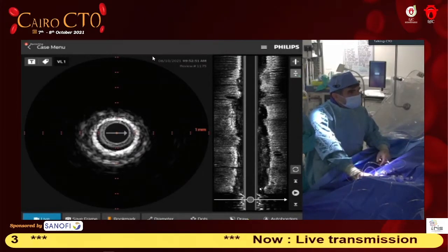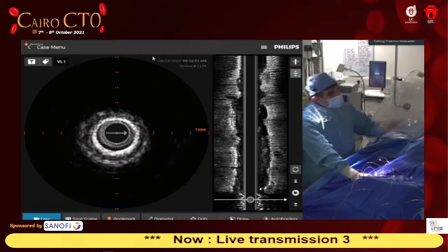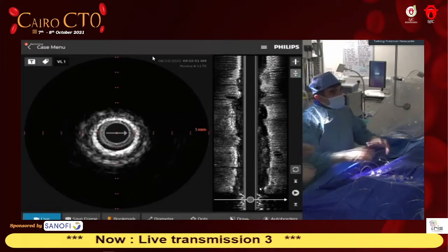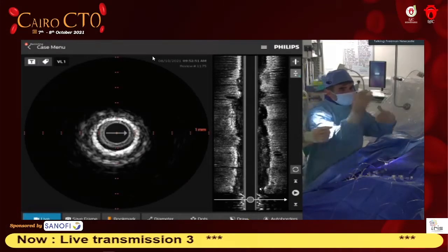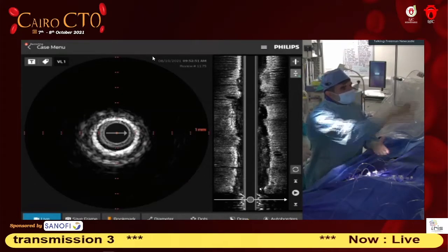So you'll put nearly 3 stents, right? I think. Yeah. I said this will grow. I've got no doubt that it's going to be bigger, but because of the nature of the disease, we're just going to start with the 3.0. And Zions could go up to much higher pressure. It could go to 4.25 if we need to. Then the proximal part will.